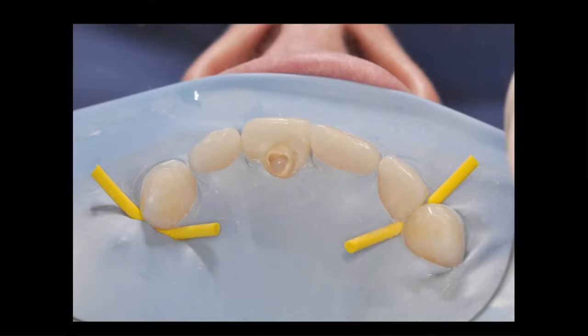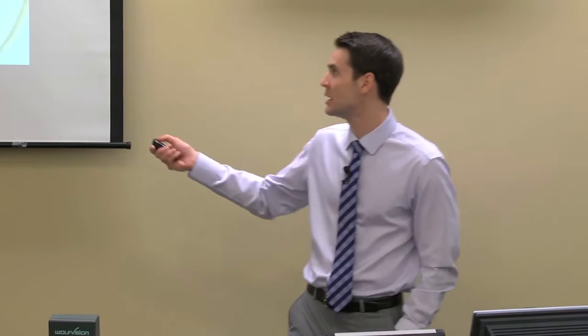I think the biggest frustration with rubber dam is, this is what we're taught in dental school, that each tooth has to have a single hole for the tooth to come through and be isolated properly, and we have to invert the rubber dam. I was never really good at that. So I prefer the split dam technique, where I just put one big slit in the rubber dam and isolate multiple teeth. And I love multiple tooth isolation.